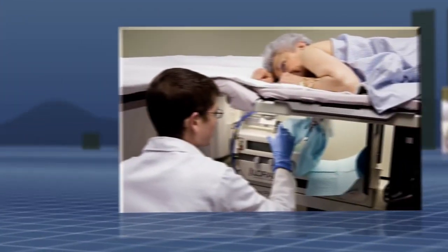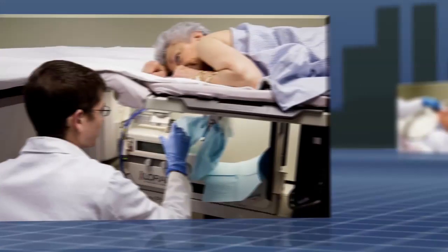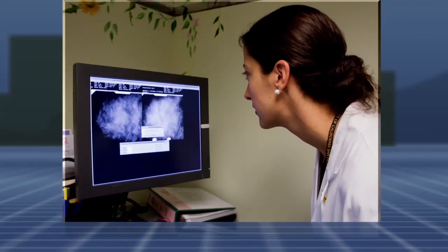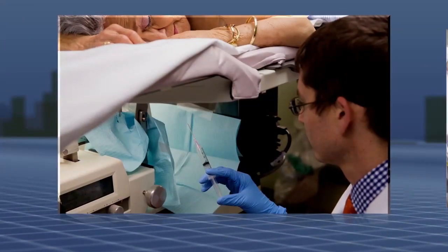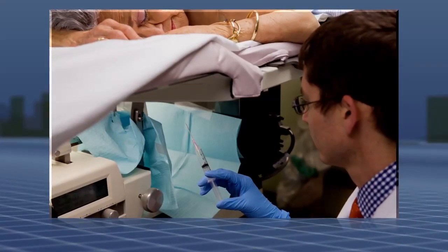The table will be elevated so the radiologist can work on your breast beneath the table. Mammographic images will identify the target area in your breast. After cleaning your skin, your doctor will administer local anesthetic into your breast. This will sting for just a few seconds.